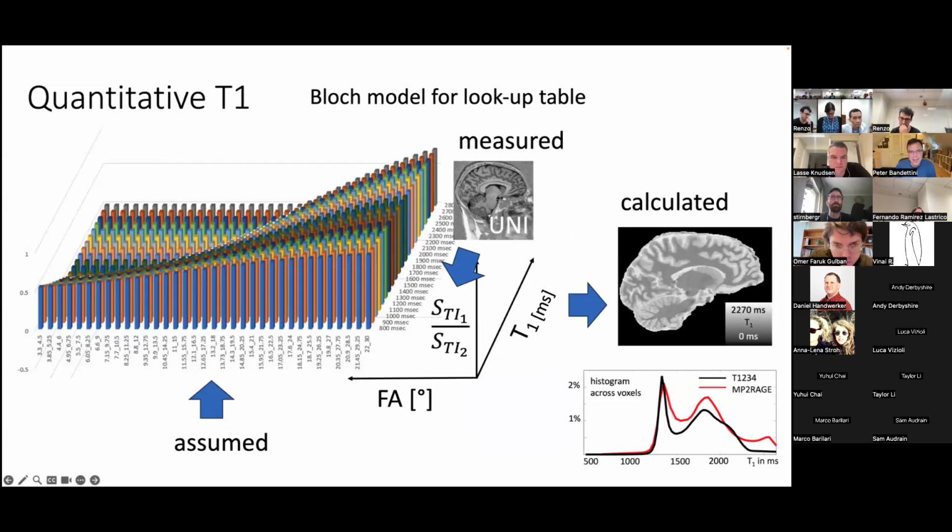The flip angle varies all over the place in space. And so those are big assumptions. People might jump all over that. But at least it looks like the data are pretty good.